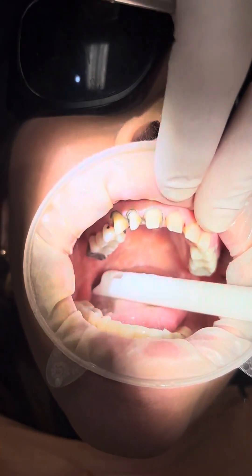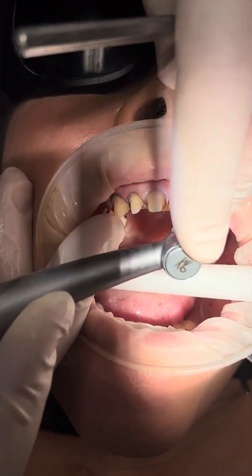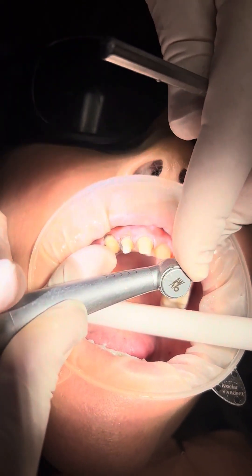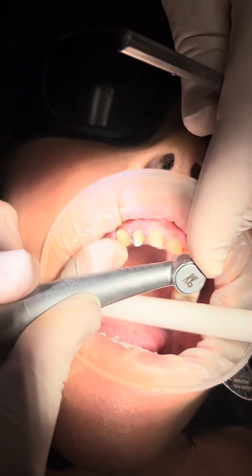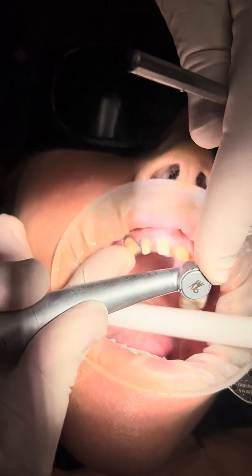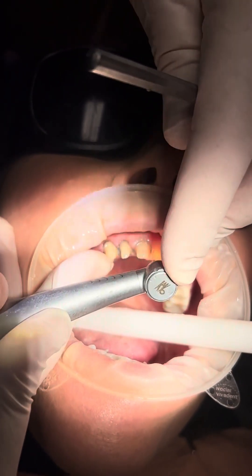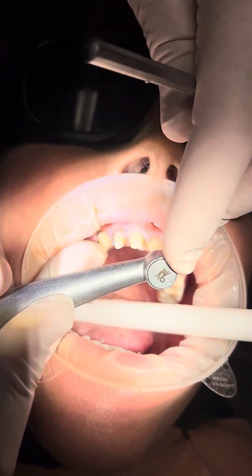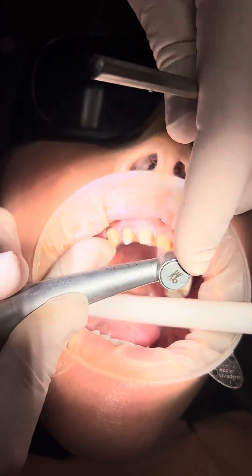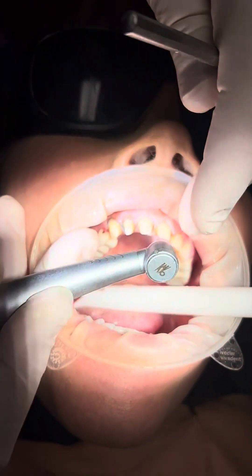Now I'm going to go to a round-end football bur. This is a round-end football — I'm going to use the coarse version with an extra-fine finger bur — and I'm going to start in the lingual area. I've got to reduce one and a half millimeters on the lingual. The lingual surface needs to be tapered, not concave. The biggest problem we see is that the dentist might reduce a mess on the lingual and make it a concave surface, but the prep was not kept taper enough on the lingual.